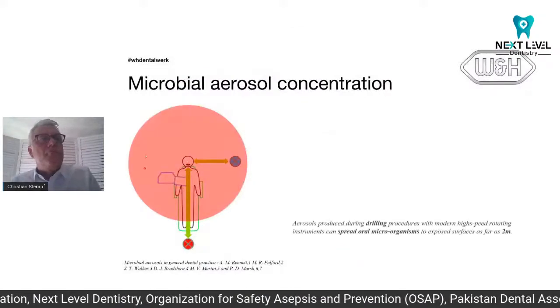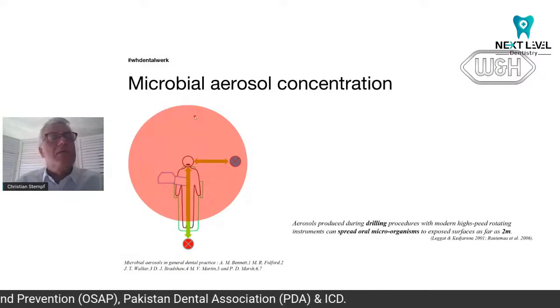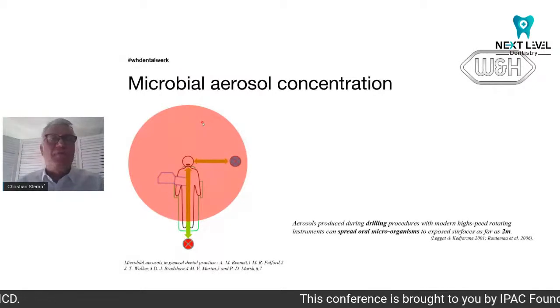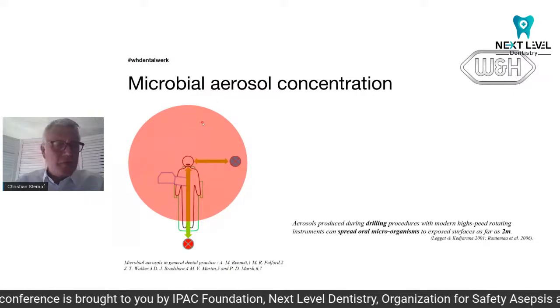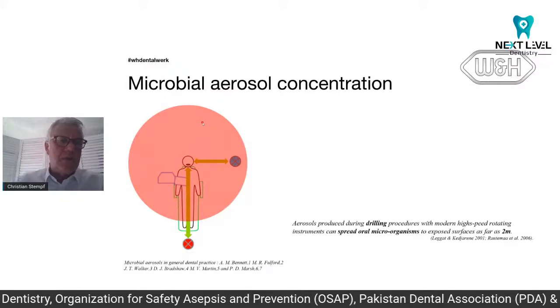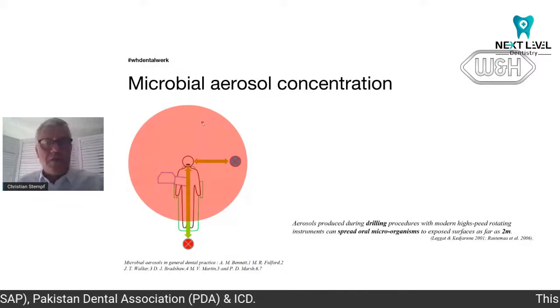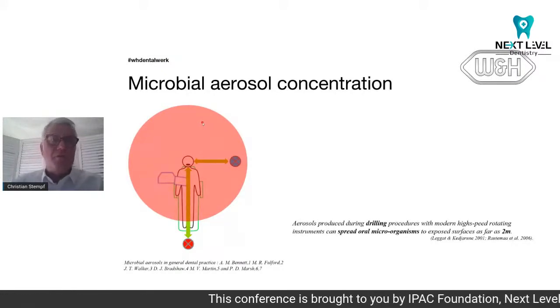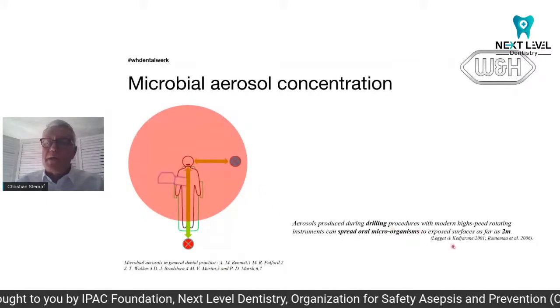Bear in mind that around the dental chair, everything is contaminated. As we've seen in the video, remove what is not used during treatment. Remove everything from the bench or hide it inside the closed drawers, because everything is going to be contaminated. You saw the burrs. Typically, you have these burrs which are close to the doctor, but the burrs are contaminated. So you either change the burrs between patients, but never reuse burrs or a holder which has been used with a previous patient. So this is proved by literature.